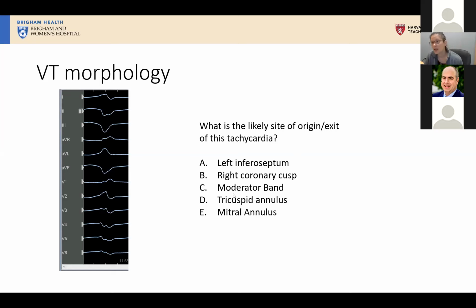And then there was just a question about specifically what wire are you guys using in those small branches? Yeah, so I know there is a Biotronik wire that's specifically available for pacing that you can use for CRT implants. But what we've just used is a standard wire. My interventionalist usually needs a coated wire to get into these teeny little branches, and he worries a lot about thrombus. So I usually use whichever wire the interventionalist wants, and then what you have to be aware of is that whatever the coated tip is not going to be represented by the pacing. So it's wherever the wire becomes more bare, more proximally, is where you're going to get your pacing from.